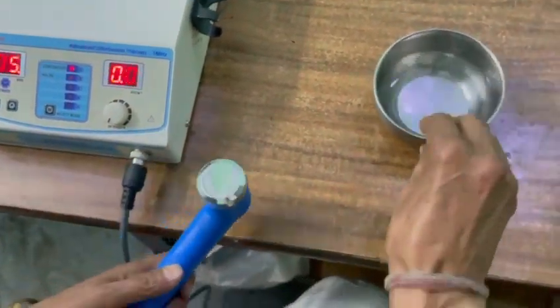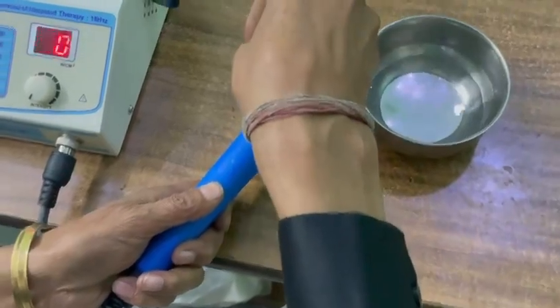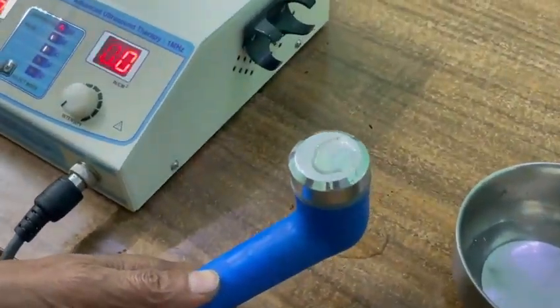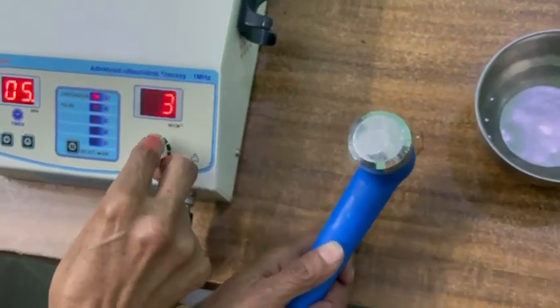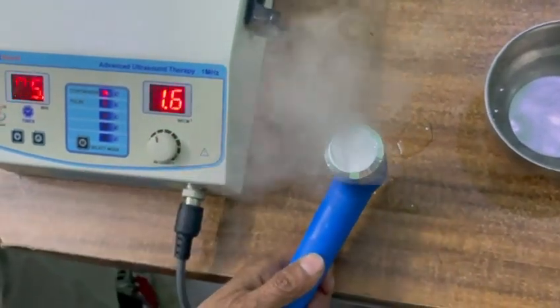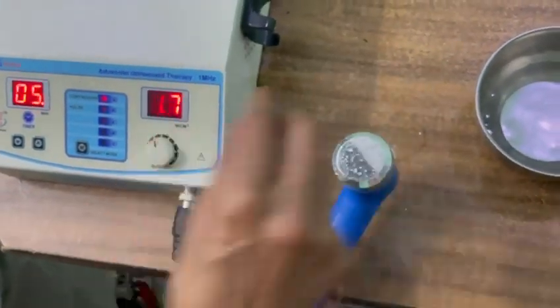Now, how to test the unit? Put some water drops on the ultrasound head and simply increase the intensity. It is working perfectly — you can see it is working perfectly.